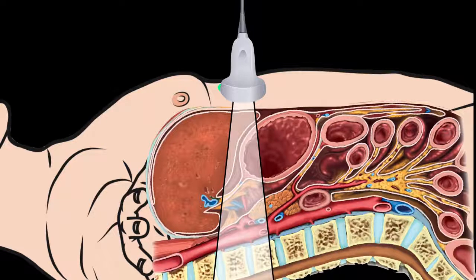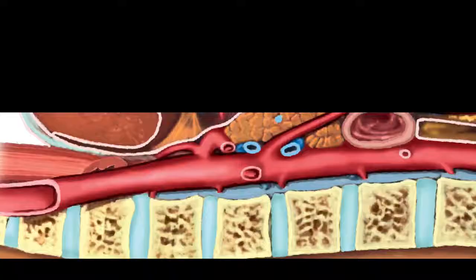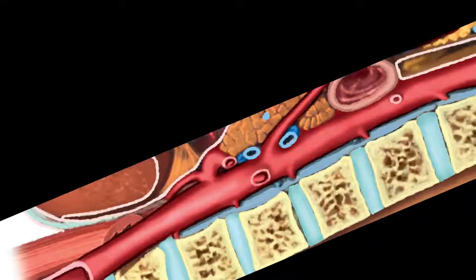What you may have to do for the very proximal aorta is gain a sagittal view with the indicator towards the patient's head, where you can see the aorta there. However, this then allows you to rock the probe to image more proximally, above the celiac takeoff and behind the liver. What this will do is take your aortic view here and angle it. Now, this also gives you that tangential view. However, because you have the celiac axis and your branch points, you can now measure the aorta. Be sure when you are measuring, you are not measuring perpendicular to the screen, but perpendicular to the aorta from outer wall to outer wall.